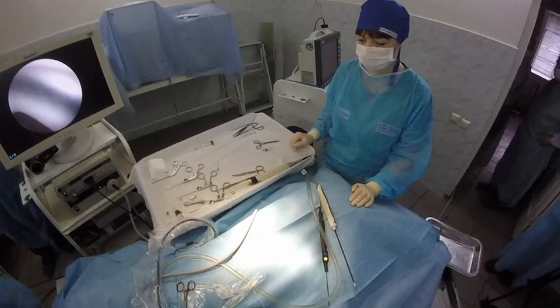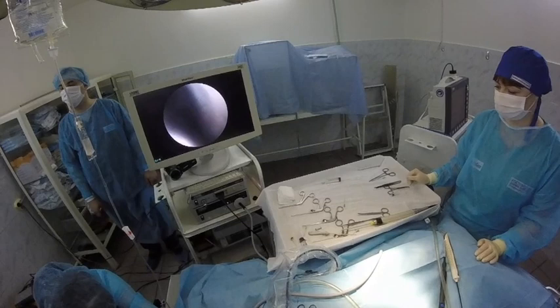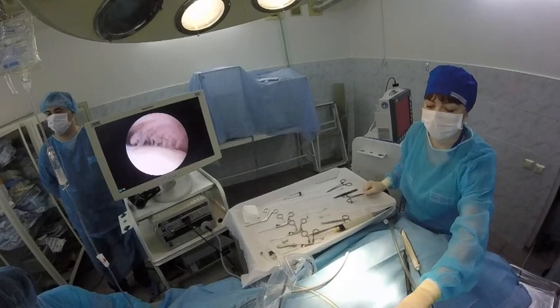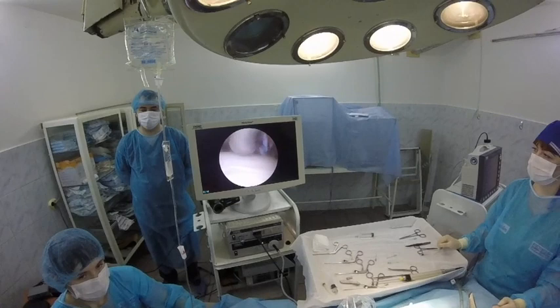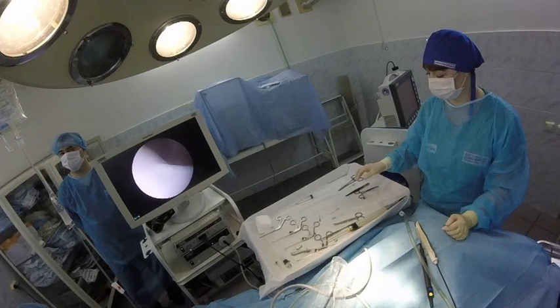Give me another needle please. We need another approach. I find the problem — problem is here. Cartilage is good, a little bit soft, but it's good. And here is the problem. I need to check the caudal part of the humeral head.